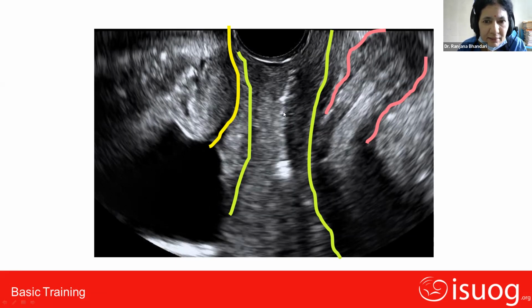This is the vaginal canal, anterior vagina, posterior vagina leading into the endocervical canal. Then it will come into the uterus. This is the anal canal leading into the rectum. So anything important, any Gartner cyst or any rectovaginal nodule or bladder nodules, we can see in this part. Whenever we enter, we should not miss any type of pathology by seeing this.